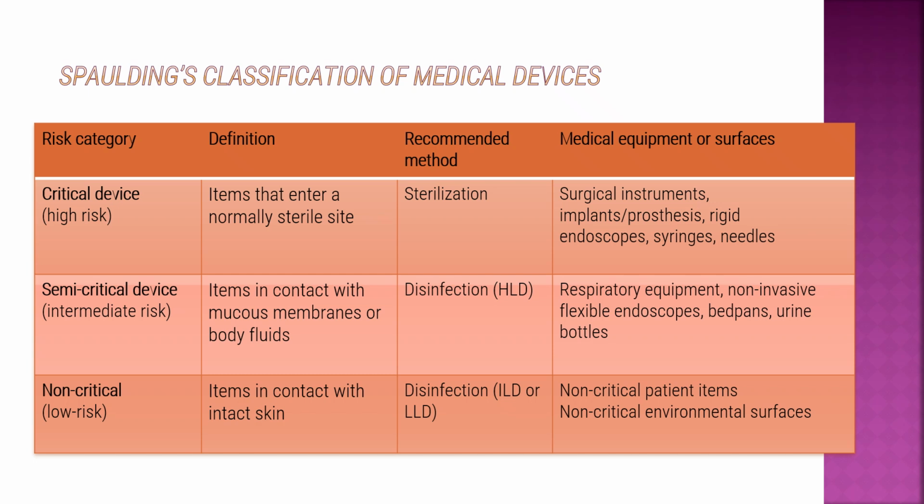Non-critical, low-risk: items in contact with intact skin. Disinfection, intermediate or low-level disinfectant. The examples are non-critical patient items and non-critical environmental surfaces.